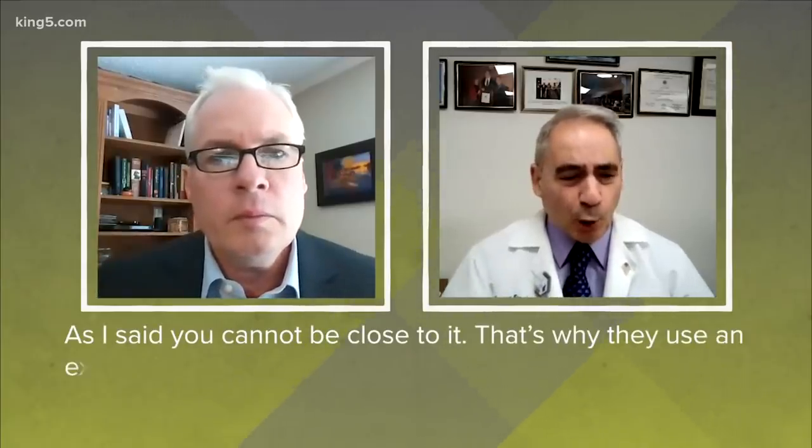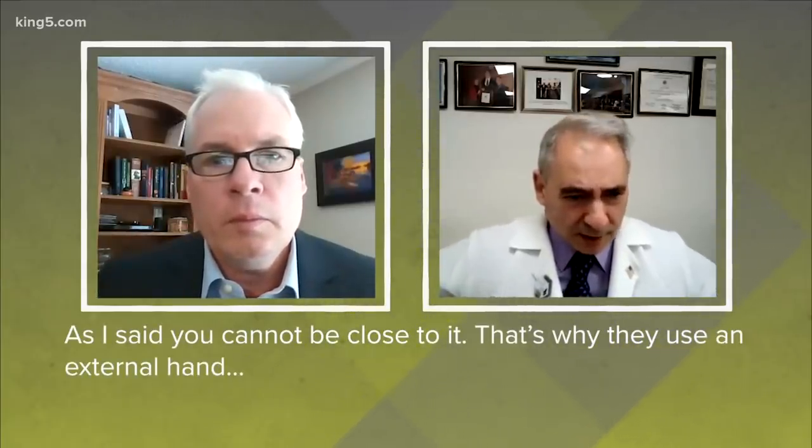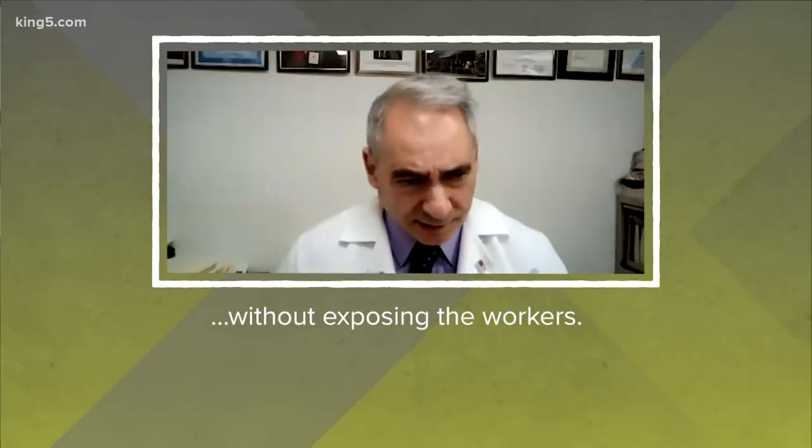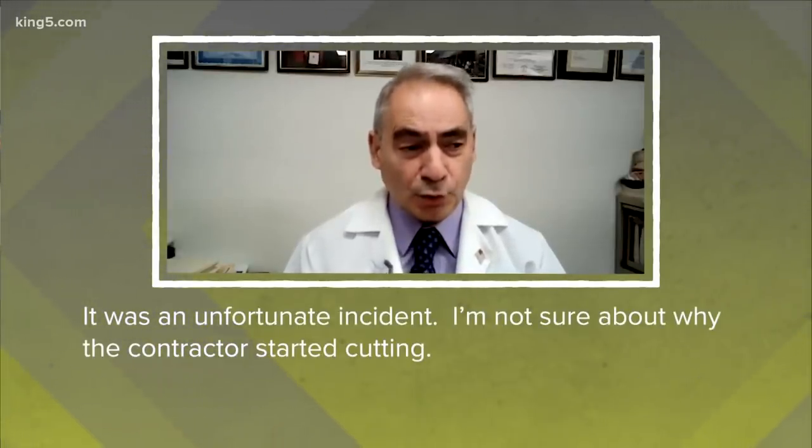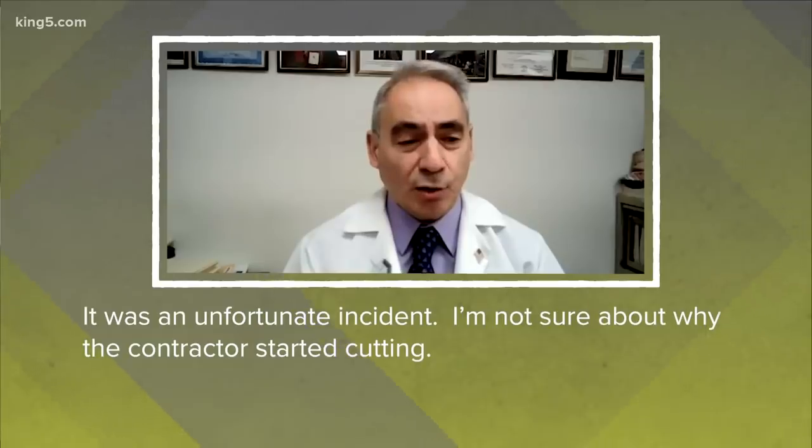We see these arms sort of grabbing the devices, grabbing the saw. What's going on there? Do you know what that process is? As I said, you cannot be close to it. That's why they use external hands without exposing the workers. The contractor, International Isotopes, was unable to unscrew the cesium capsule from the holder pipe as planned. That's when the cutting started, something federal investigators later said was not permitted. It was an unfortunate incident. I'm not sure about why the contractor started cutting.